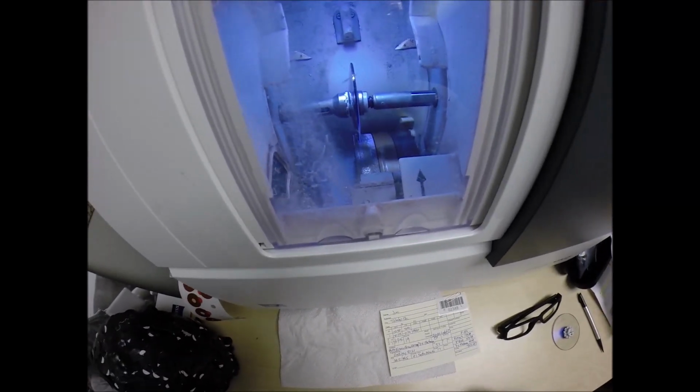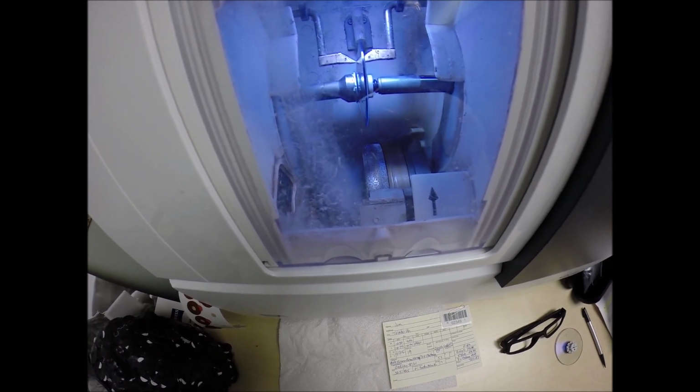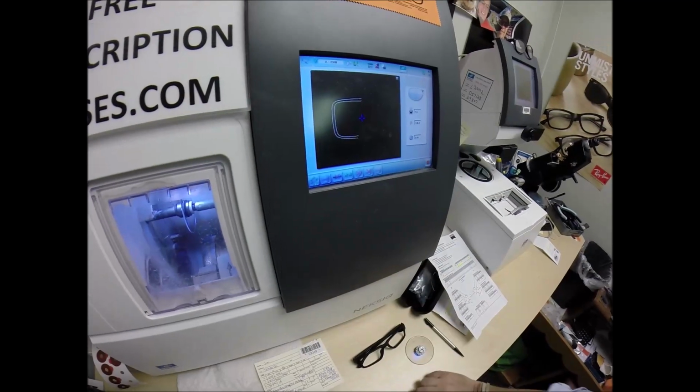So, the clamp shuts. The lens is going to be traced by two white styluses. Going around and trace the shape of the right lens first.